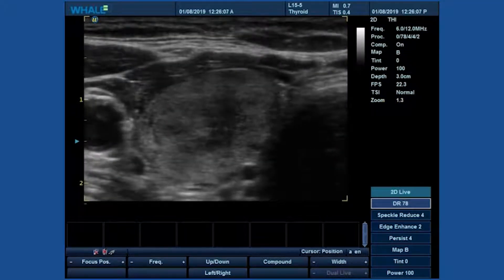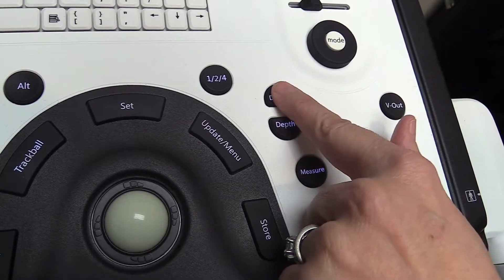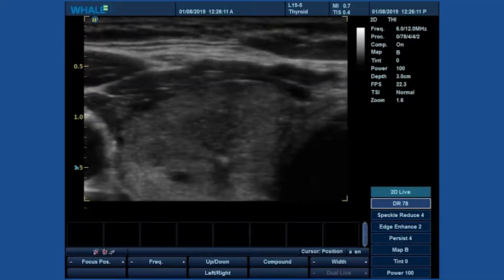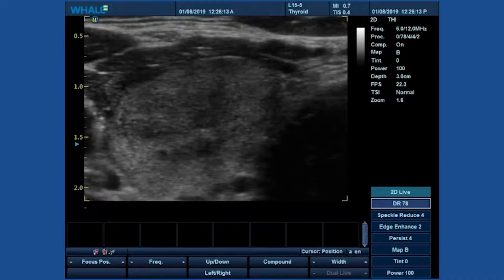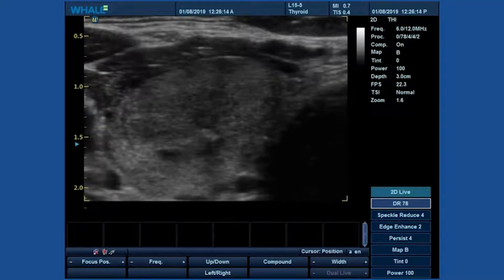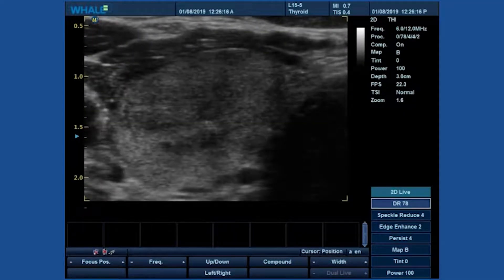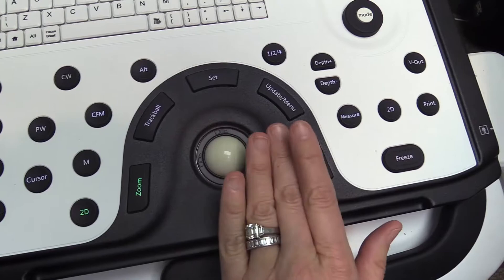To increase the zoom, use the depth plus key. If you lose sight of your imaging area, you may use the trackball to pan around the image.